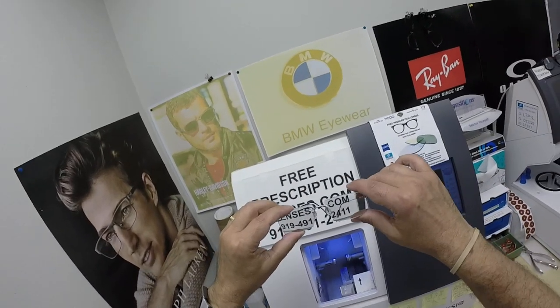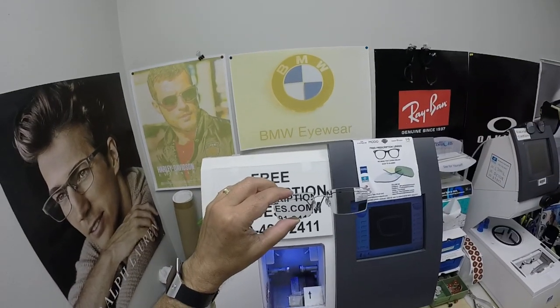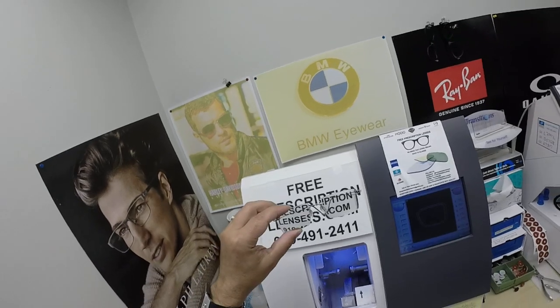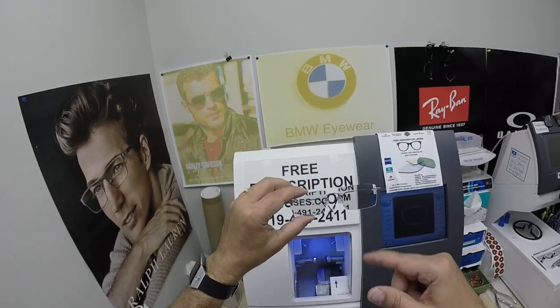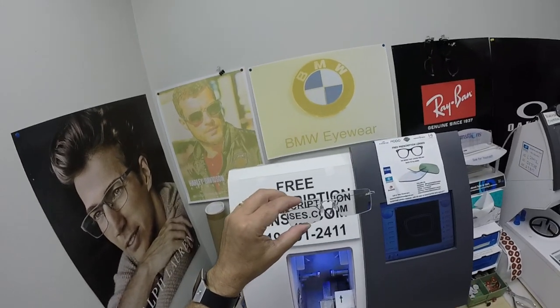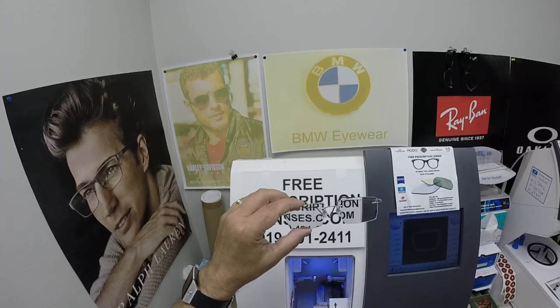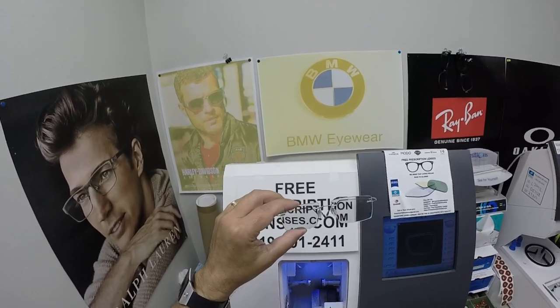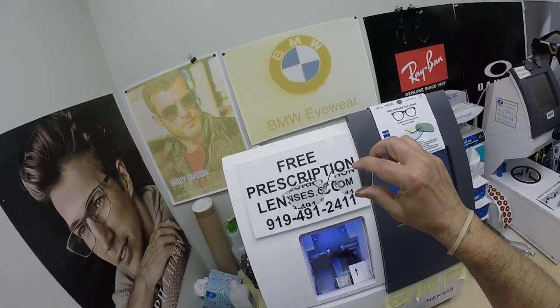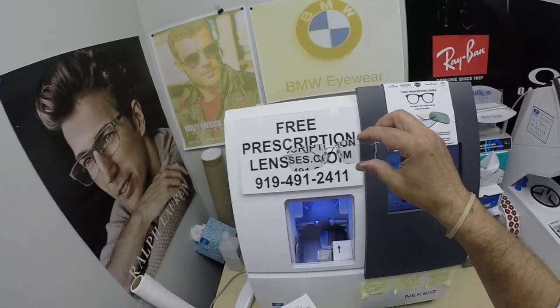This frame sells for $299 — cheaper than anywhere else on the internet — and it comes with one free pair of clear single vision prescription lenses. You can do any add-on like he did: the 167 High Index, the Photofusion Pioneer Green X Edition along with Duravision Chrome. The Photofusion Gray, Brown, Green, and Blue adds $99. The Duravision Chrome is $69. All prices are tax-free with free shipping anywhere in the U.S., because you guys drive a hard bargain.